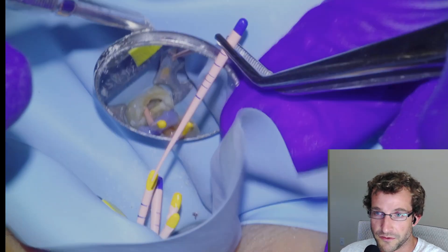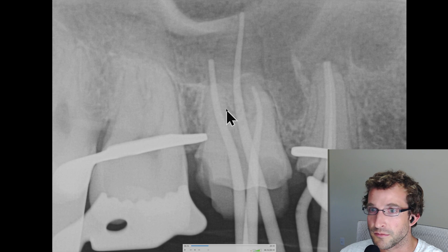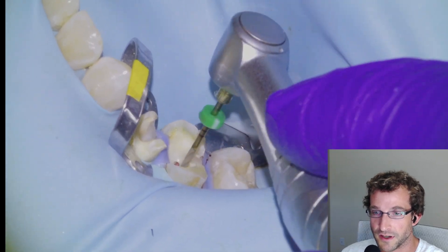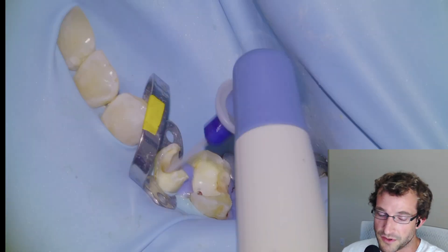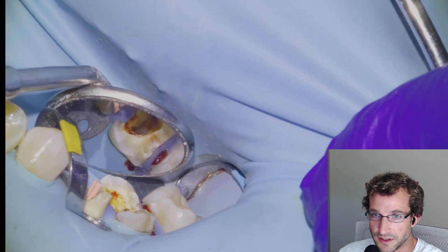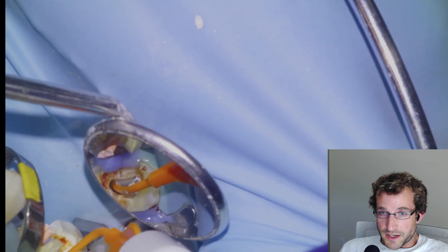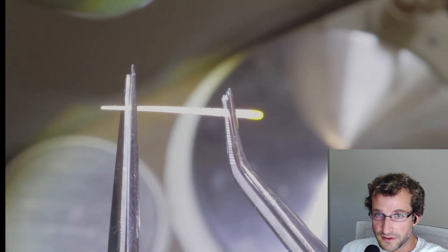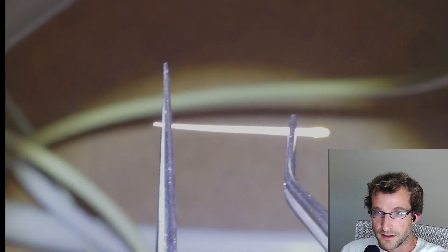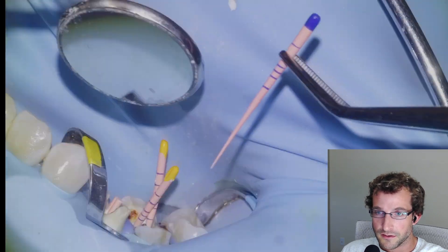I'm just going to snip that — I think those are F5s or F6s, the biggest cone we have. The final looked a little bit better but still out on the mesial buccal so we'll snip that one too. Went a little bit long but better long than short. We'll irrigate and dry, use the endo activator, irrigate thoroughly. It looks like we've already obturated the 5. So we'll dry all canals and then put our sealer in, snipping the palatal and the mesial buccal to our determined working length.